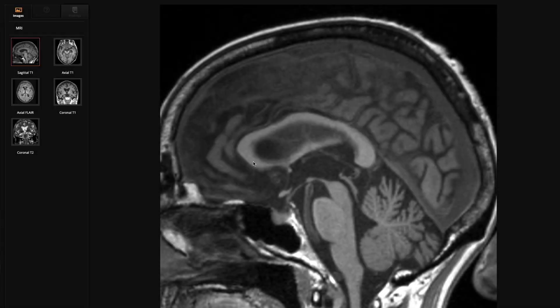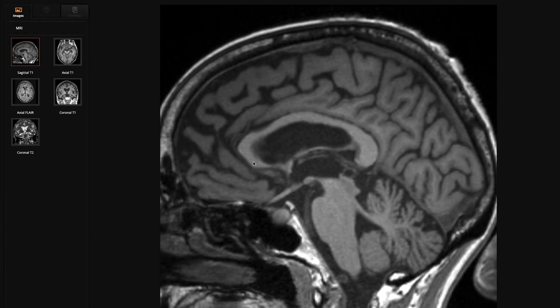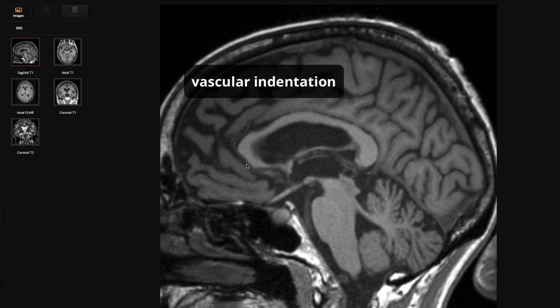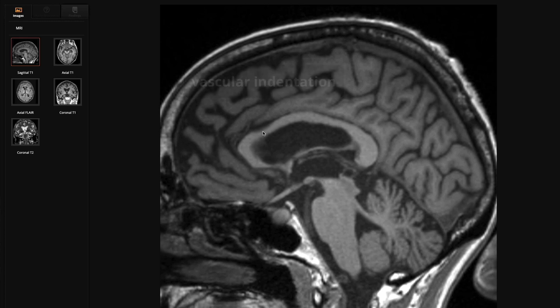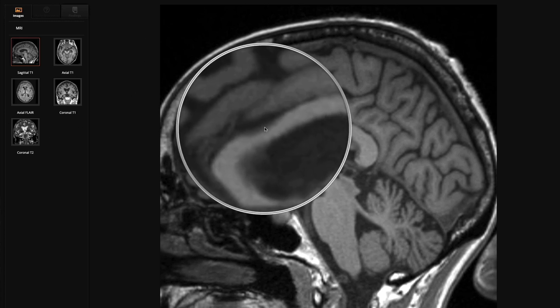So we look at the corpus callosum. Well, it's a bit ratty up here. This focal defect here — don't get too excited. There are vessels that run over here, branches of the anterior cerebral artery, the pericallosal artery, and they are quite tortuous in some patients. And they can indent the superior surface of the corpus callosum, making it look like there's a whole bunch of pathology.